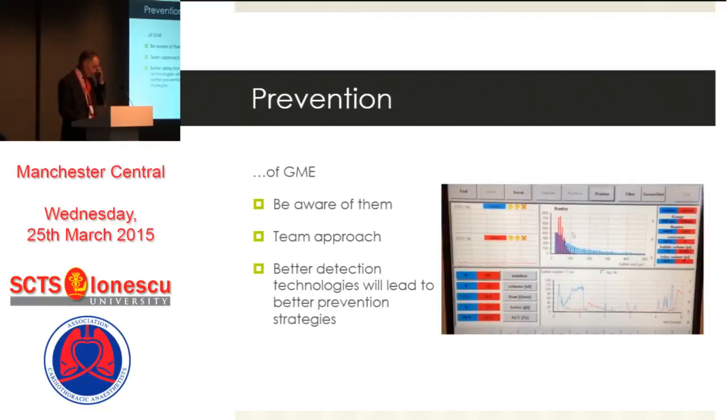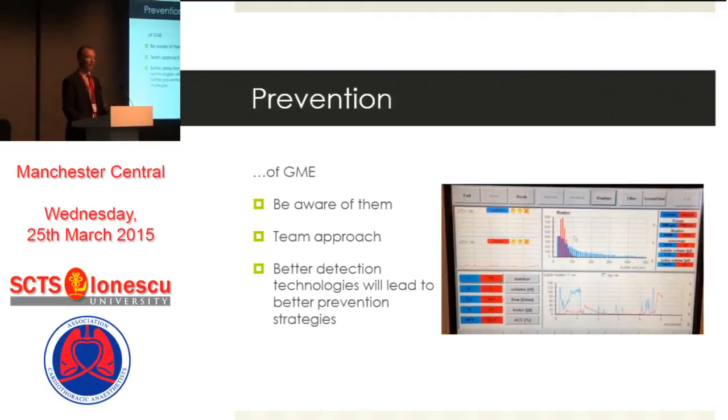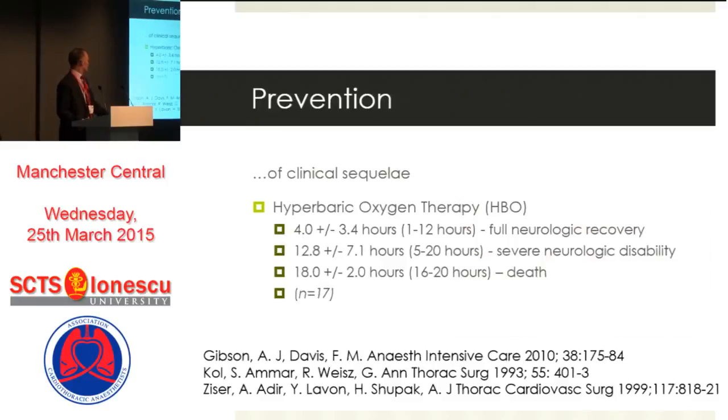You just got that. There's nothing that sits you up quite as sharply as when you hear sounds like that when you do something to the patient and you realize that that is thousands of GME being delivered at least into the venous line, but rapidly being transmitted, as you saw the red curve grow, into the arterial line.